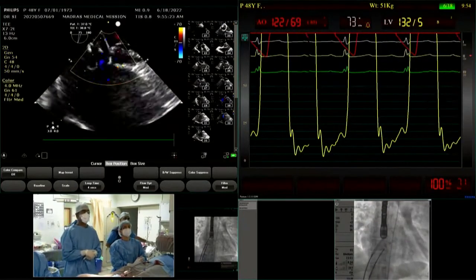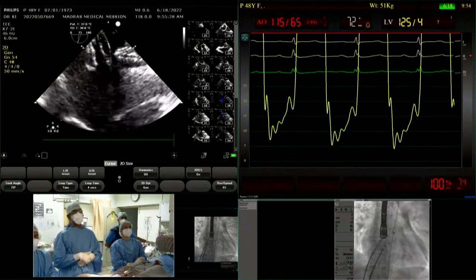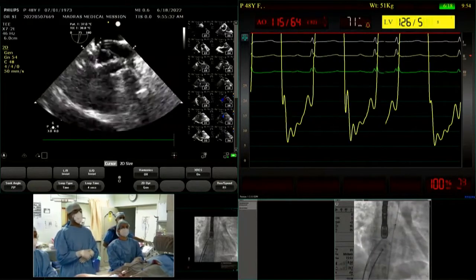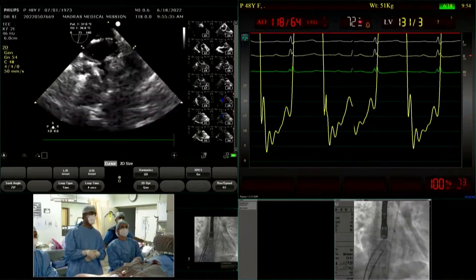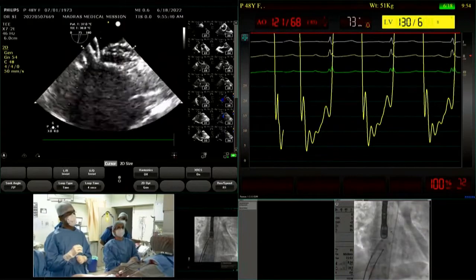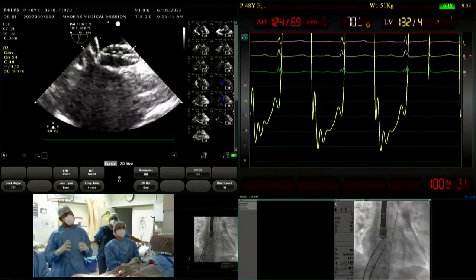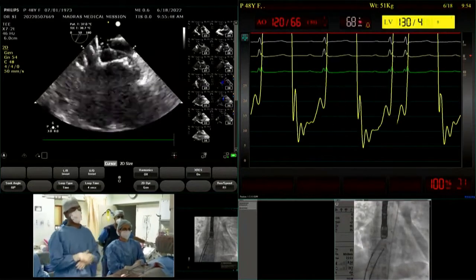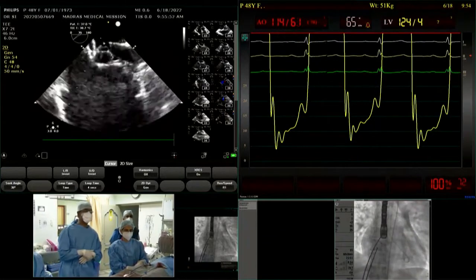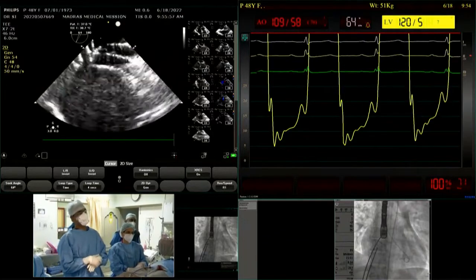Beautiful case, sir. Thank you so much, Babesh. Yes, sir. It looks nice. Thank you. The LVEDP is marginally on the higher side. It is coming to almost around 18 to 20. But we need to remember that the patient is on positive pressure ventilation, which itself will increase the end diastolic pressure a small amount, around 2 to 3 millimeters of mercury, because positive pressure ventilation tends to increase the intrathoracic pressures and leads to an increase in the end diastolic pressures. So we are confident that we will be able to get her out without any need for leaving behind a fenestration.